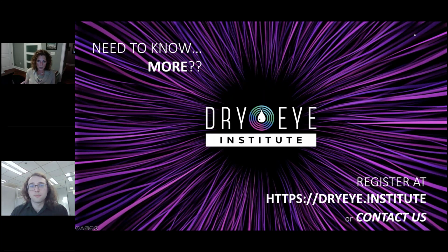Have it in the workup room. Every patient gets the screener, but schedule your dry eye evals last before lunch and last before end of day. That way, when the machine needs to be used for 6 to 10 minutes, there's not a routine exam right behind them waiting on the auto refractor. And you can get as many viewing stations as you want, so every exam room would be able to view it. They just can't capture it because the bowl's not in there.